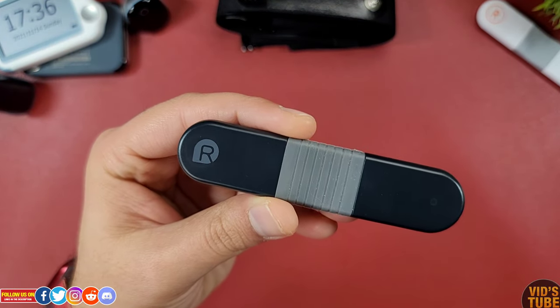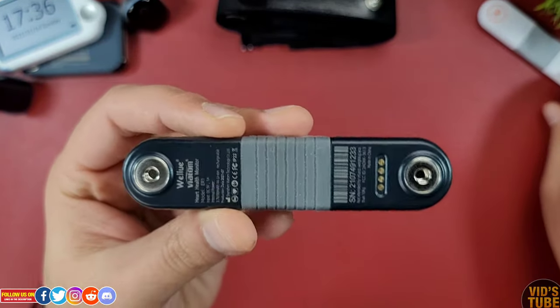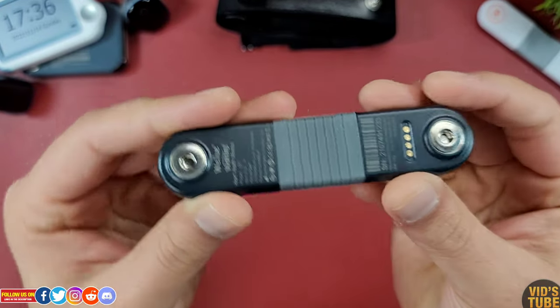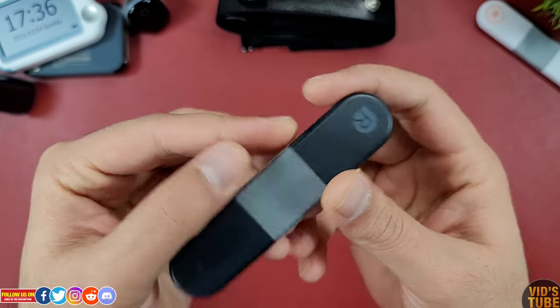The AI ECG recorder itself is very lightweight and compact. It contains two parts with the electrode attachment site, and both these parts are connected by a flexible joint. At the front, the right side is marked and highlighted.